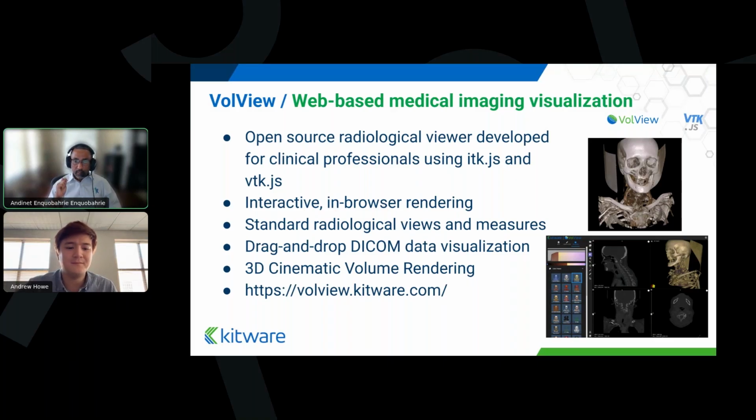And when you're interacting with your DICOM storage, if all that is secured, then that would satisfy one of the requirements of HIPAA compliance, right? But HIPAA compliance has other additional requirements. For example, physical storage. The data that you're storing has to be physically secured. There are additional processes and procedures that you'll have to satisfy to be HIPAA compliant.